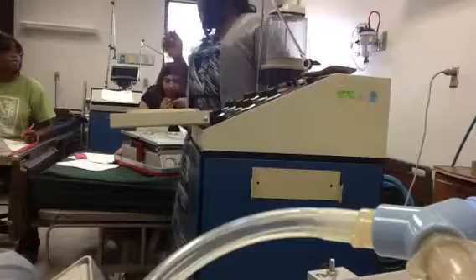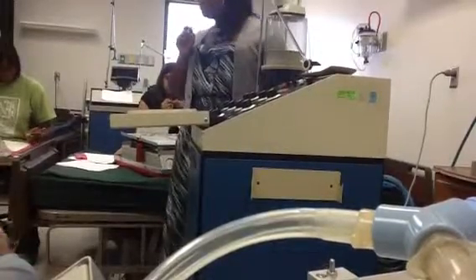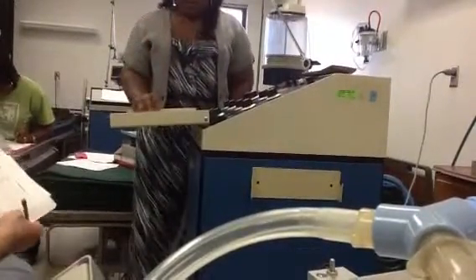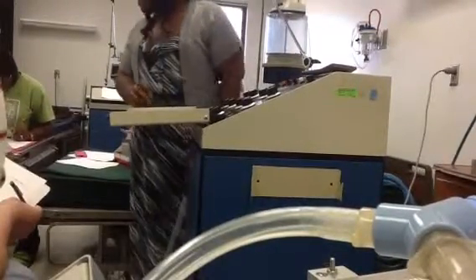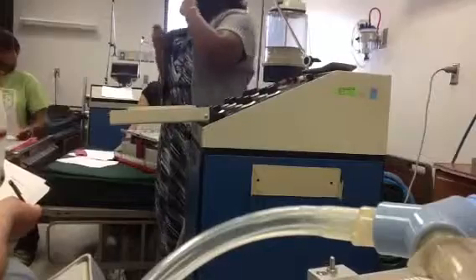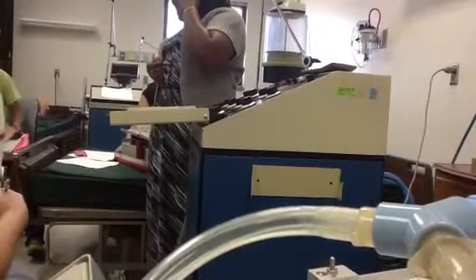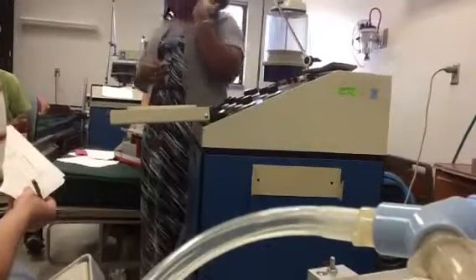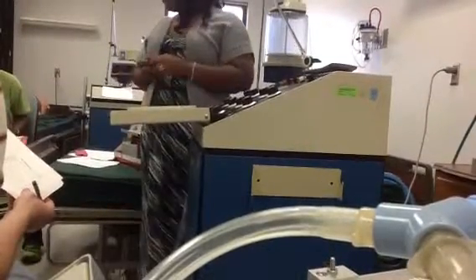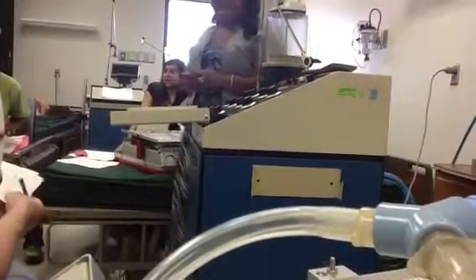Check your ETT placement on your patient. You've been pulling and yanking and pushing and all that, so it may be out. So check the teeth or gums. Where is it supposed to be at? 19 and 21 for female, 21 and 23 for male. Well, where is it supposed to be at? You can't just put looks good on there. You're not just gonna be like, what looks good? You gotta put where it's at.